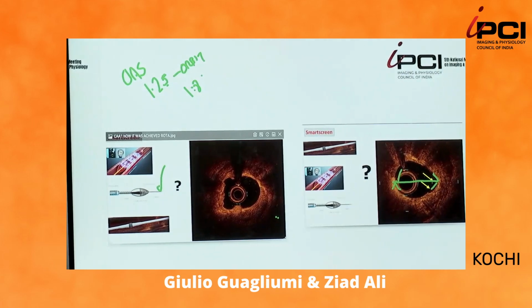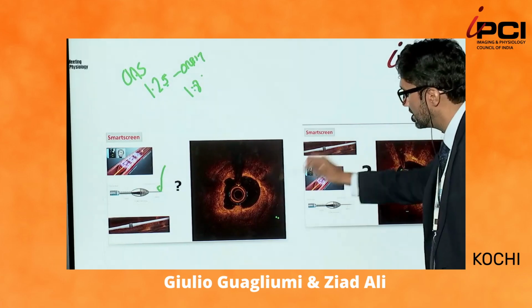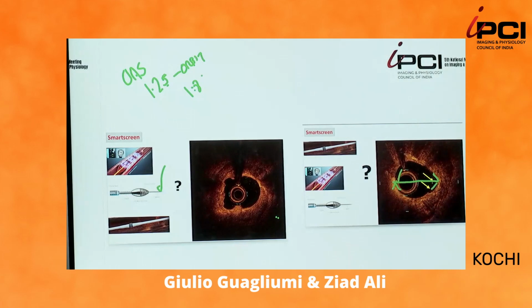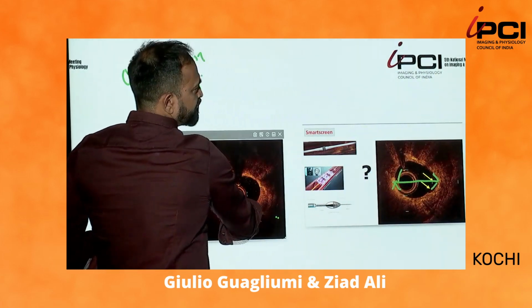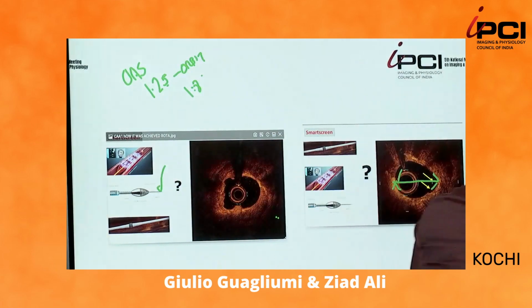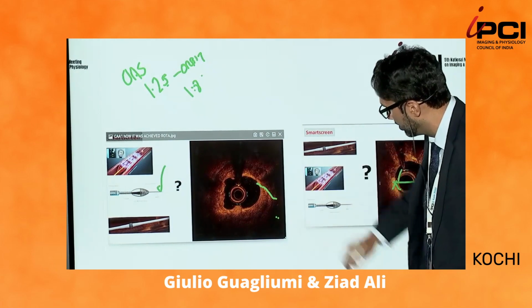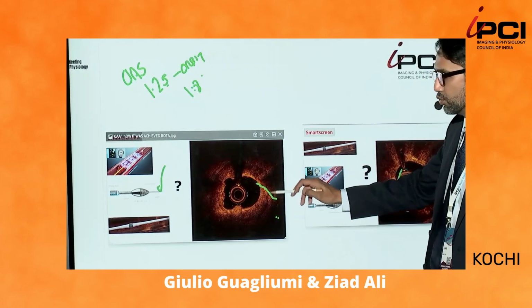Now, Giulio asked a critical question. Am I done here? When does calcium start to fracture after you've modified it? How is this going to crack or not? The thickness of that, if it is less than 500 microns, then it's most likely. Absolutely. And in fairness, in this specific case, you're going to crack here, because actually this is a segment of fibrous tissue between a calcified plate.